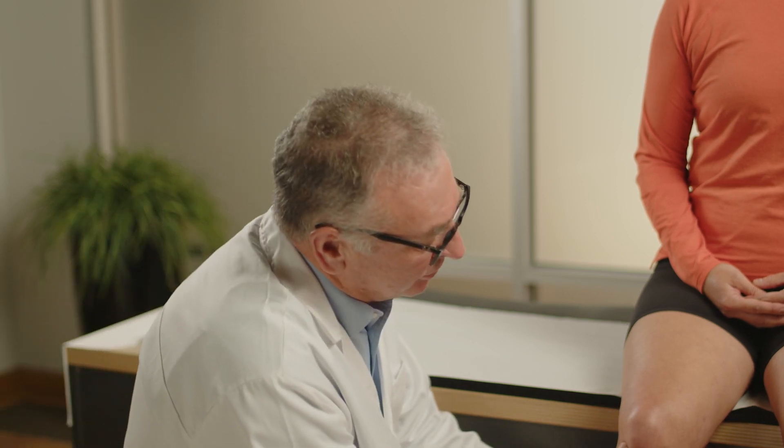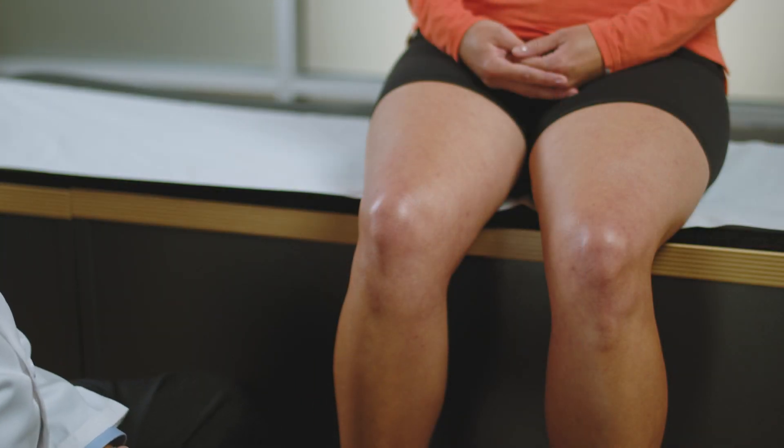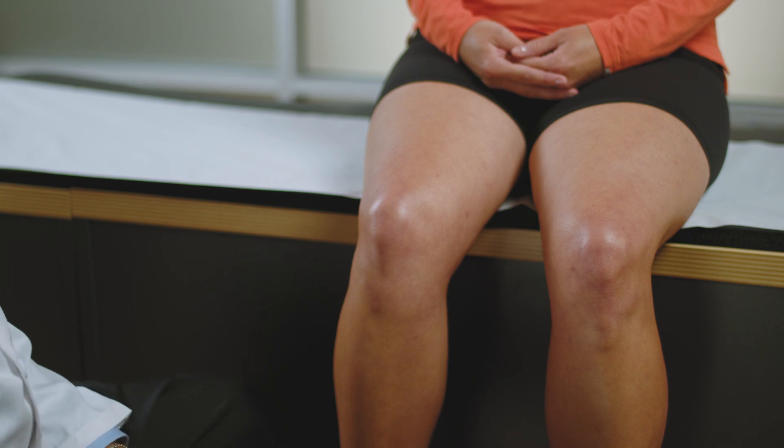Positioning the patient is really important to ensure maximum comfort, and it will depend on the route of injection you are going to use. In the first instance we're going to demonstrate with the patient sitting on the edge of the examination table, and that will be for the inferior routes of injection. Let's start by identifying the anatomical features of the knee and then I'll talk about the six possible ways of doing this injection.